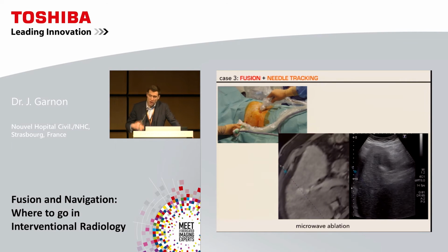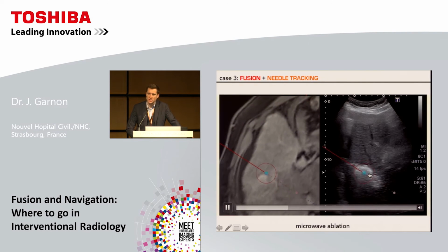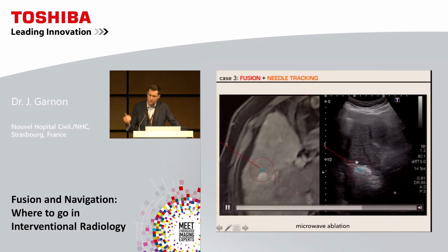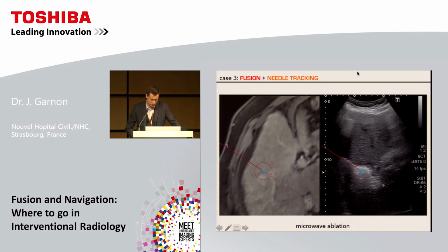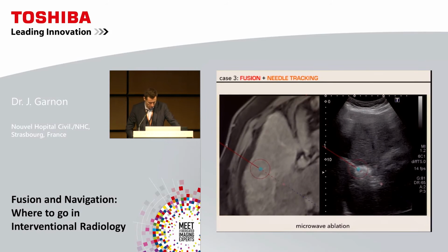to access that. And once you have done the microwave ablation and you want to cauterize the tract, you will overcome the problem of gas formation. Look at this. You have so much gas that you don't see where the tip of the microwave antenna is, and then by activating the needle tracking software, you can see that the tip is here, and you can know what the length of the cauterization you have to do is. So clearly, very convenient tools for the liver.